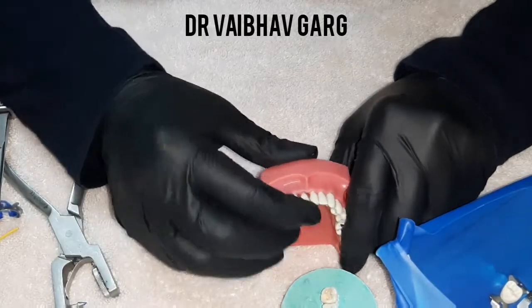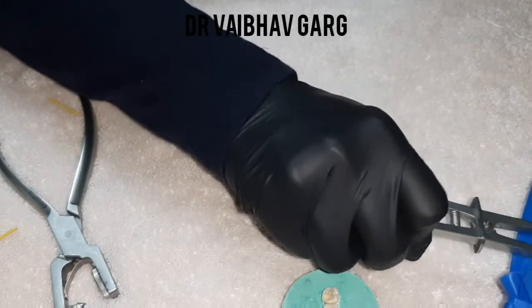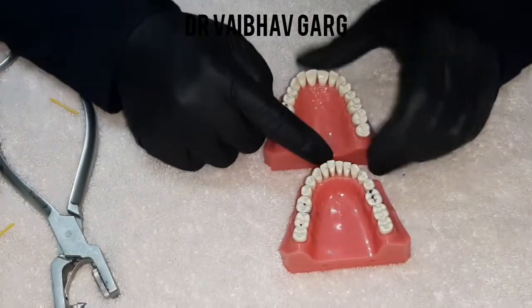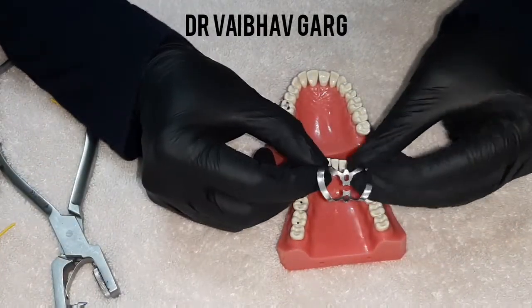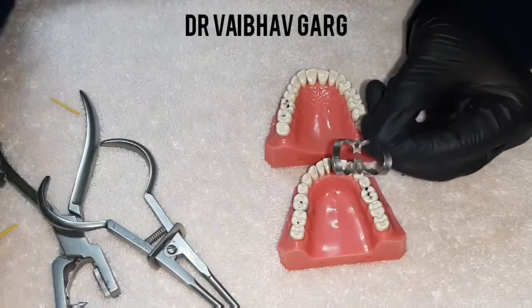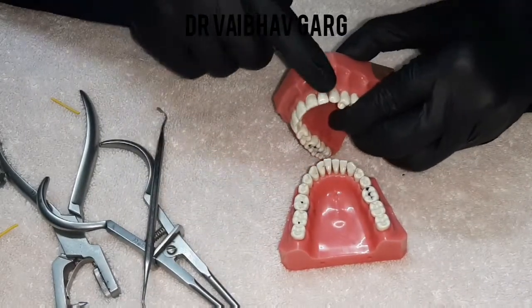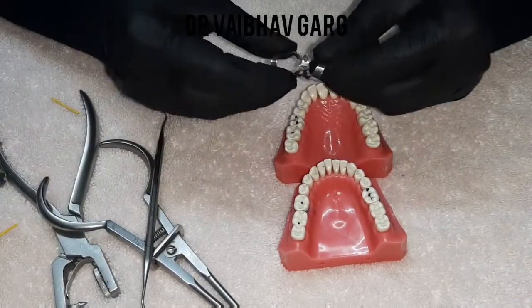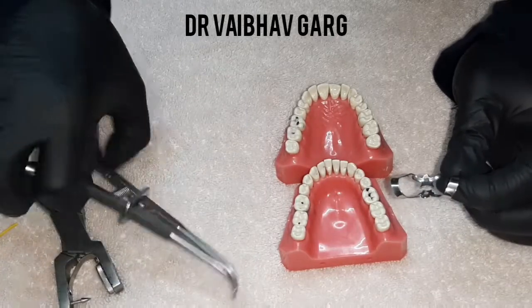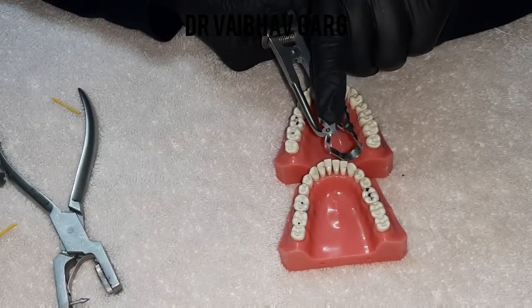The next part of this video covers anterior teeth — I will teach how to isolate them. When anterior teeth have to be isolated, make sure you are using the right kind of clamp and placing it properly. The clamp with limited space and a very short area is used for lower anteriors and lateral incisors of the maxilla. The bigger clamps are used for anterior teeth. Following this surface, this has to be on the buccal surface of the tooth.